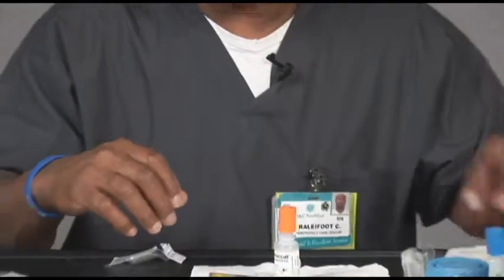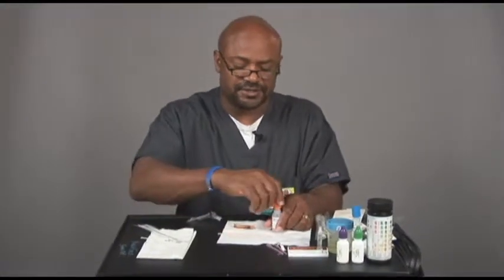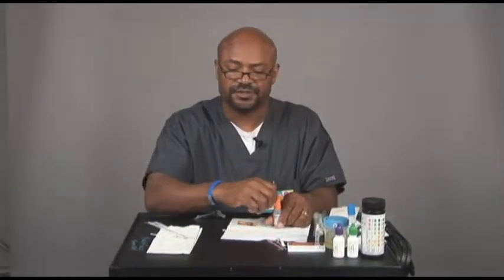And that is most of the point-of-care testing that we perform in the emergency department. The thing to remember about ours, we record the urine pregnancy test, strep test, Hemocult and gastrocult in our AccuCheck machine. And we'll cover that on your first day with us here.